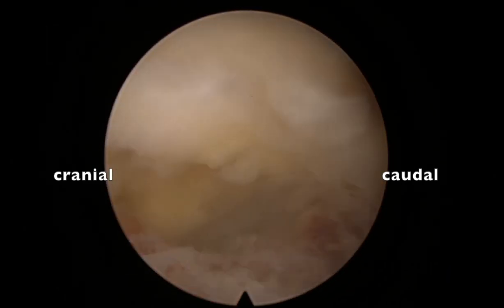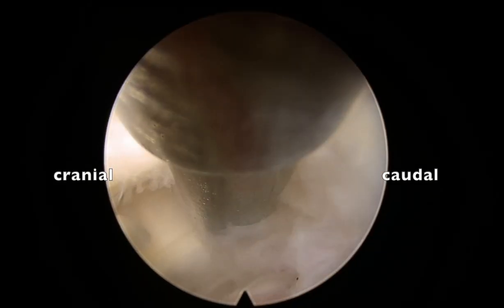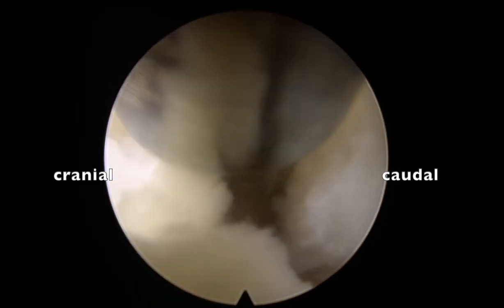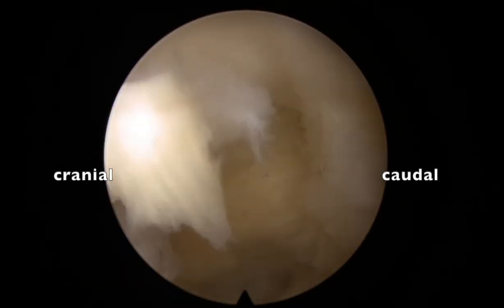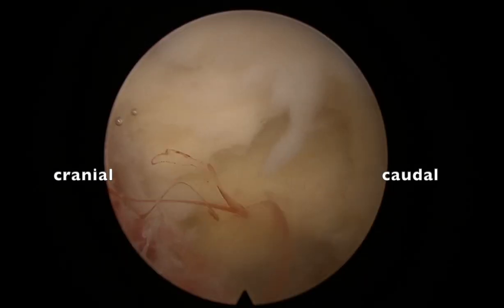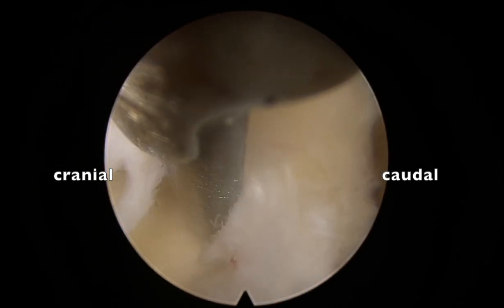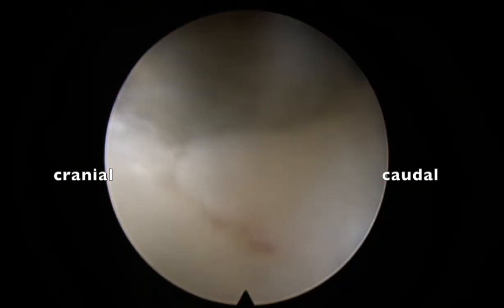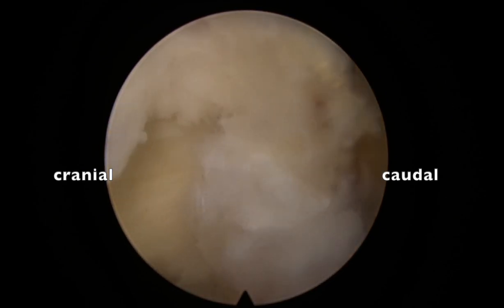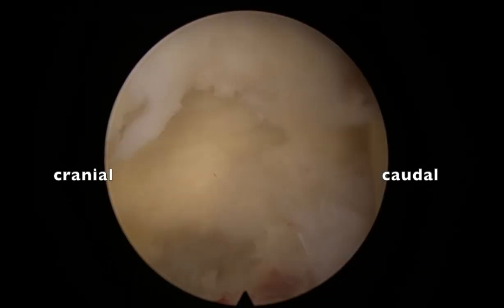Once done, I remove the superficial layer of the yellow ligament. Here there is lateral stenosis and the ligament is thickened. Removing the superficial layer makes opening of the yellow ligament easy later on. The entire gutter is clearly seen. I remove the superficial layer from the upper lamina edge to the lower lamina edge.